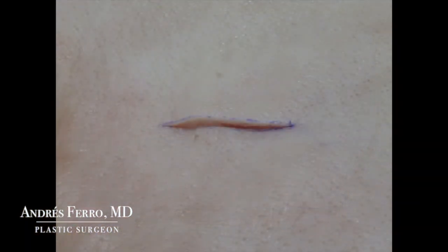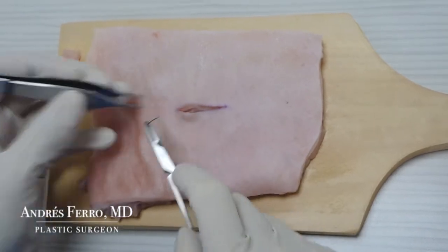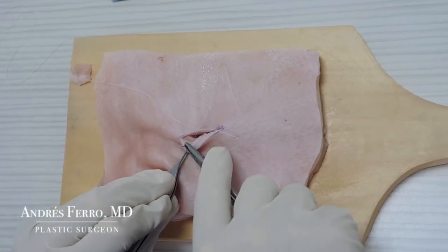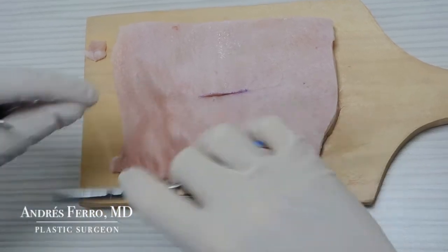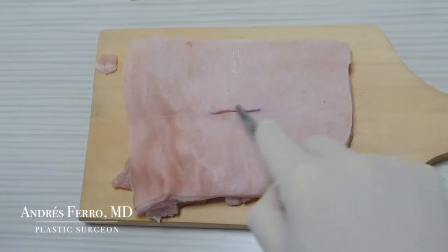In order to maintain the height difference between the wound's borders during the practice, do a deep stitch on the subcutaneous fatty tissue of the unmodified side of the wound, attaching it to the deep dermis of the side where the fatty tissue has been removed. After knotting this stitch, the height difference between both of the wound's edges will be maintained.